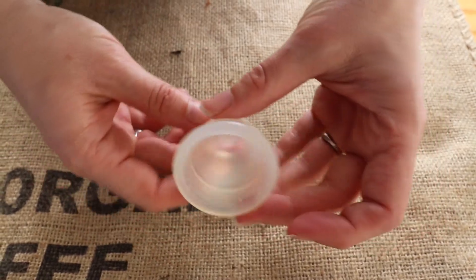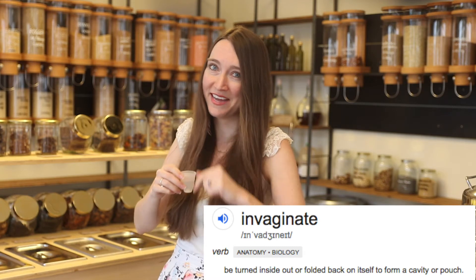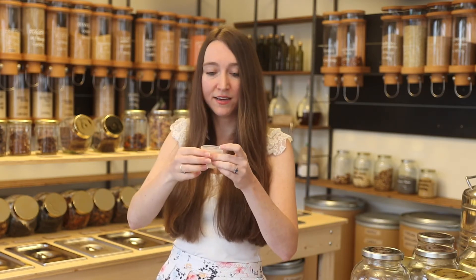Since it's not designed to be invaginated — that means to be flipped inside out, pun intended — I can't recommend doing this because it's not the way it's intended to be used, but I use it flipped inside out and it works really well.